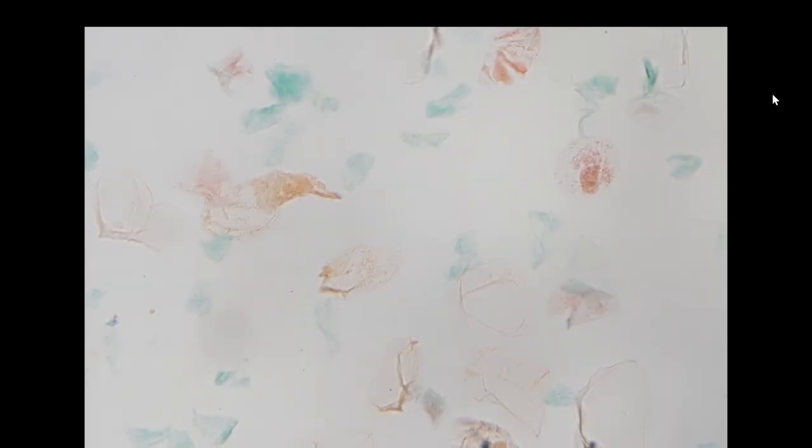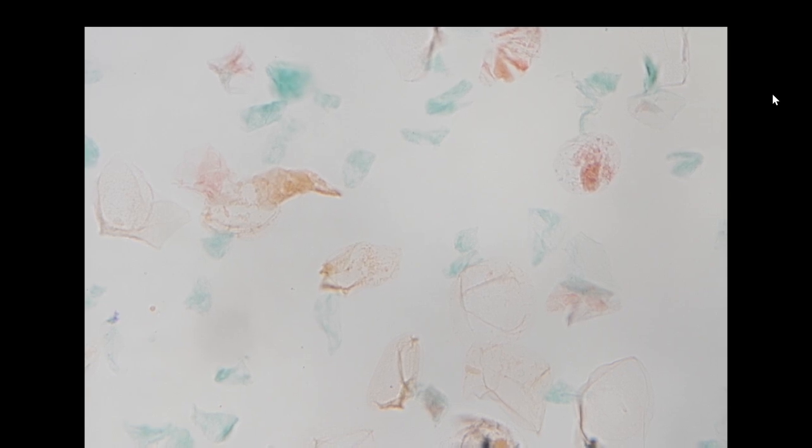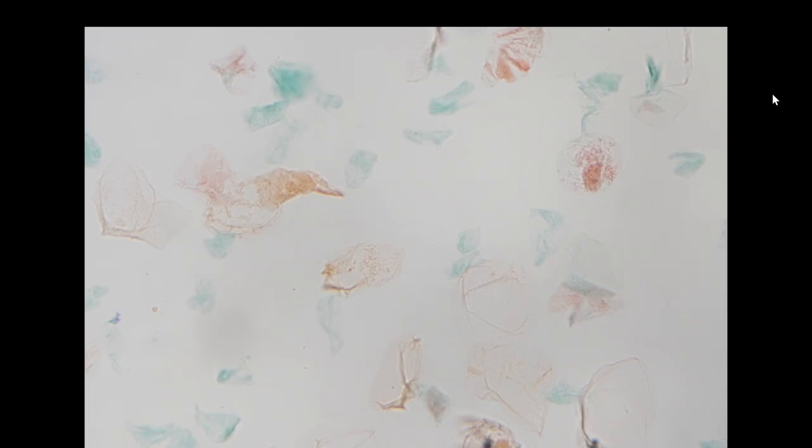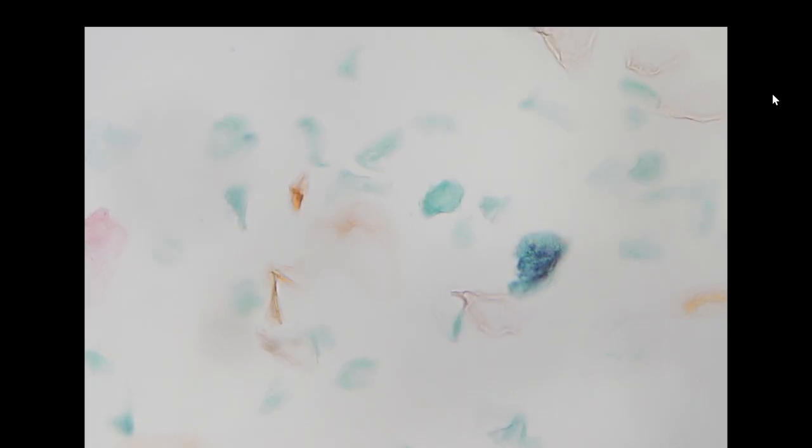We only see anucleated bland looking squamous cells compatible with maybe an epidermal cyst, not ruptured, but because the location is unlikely, it seems to be more deep-seated, or it can be a branchial cleft cyst, but overall it looks like a benign squamous cyst. Okay, so that's for all the cases today.